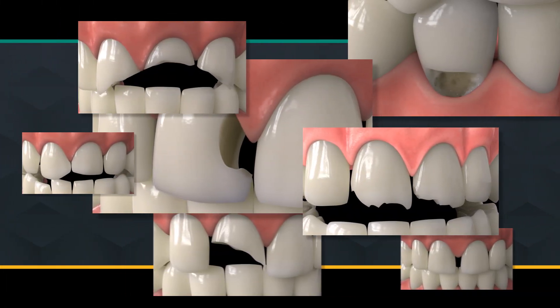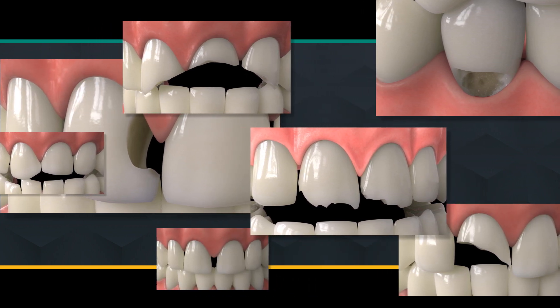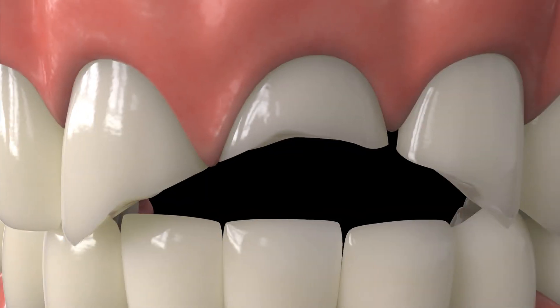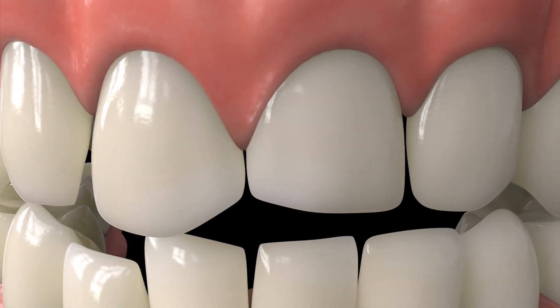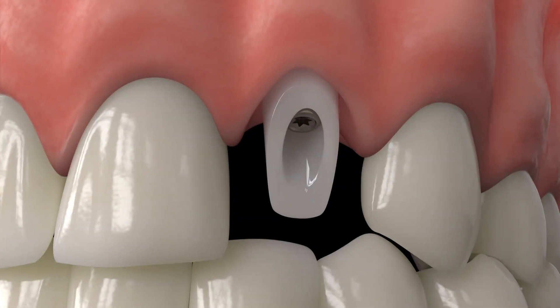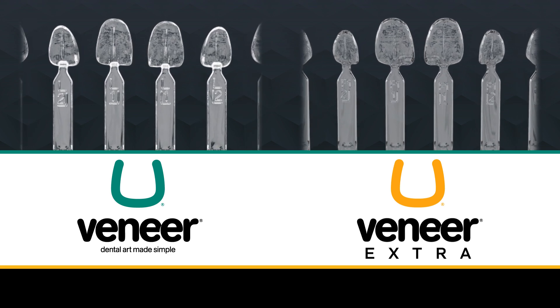Uveneer and Uveneer Extra templates create predictable, reproducible results for a variety of procedures, including composite veneers, class three, four, and five restorations, diastema closure, anterior fracture repair, incisal edge repair, misshapen and misaligned teeth, missing tooth repair, custom shade guide, peg lateral composite veneer, temporary on-implant abutment, and more. Uveneer templates allow you to give your patients the smile they want in a matter of minutes.